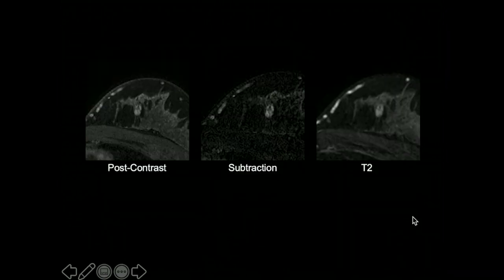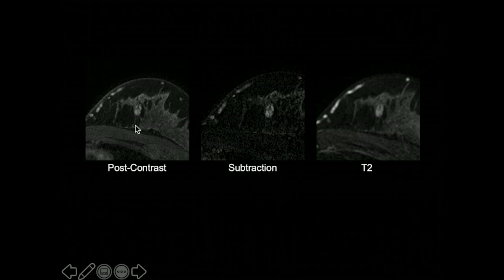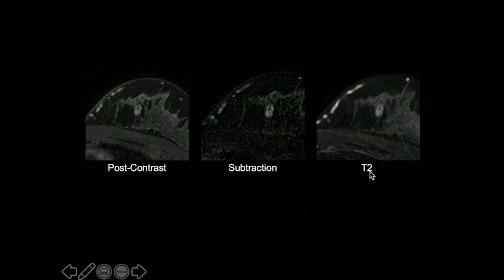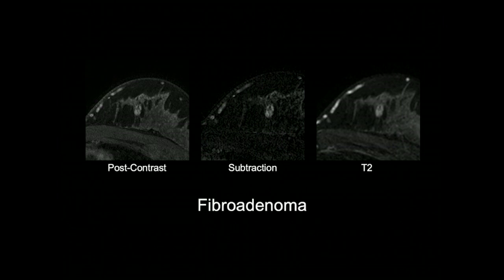In the next case, post-contrast, subtraction, and T2 images show a three-dimensional mass with dark internal septations visible on both post-contrast and subtraction sequences. This is an oval mass with circumscribed margins that is T2 bright. With T2 brightness, oval shape, circumscribed margins, dark internal septations, and benign persistent kinetics, this is consistent with a fibroadenoma.